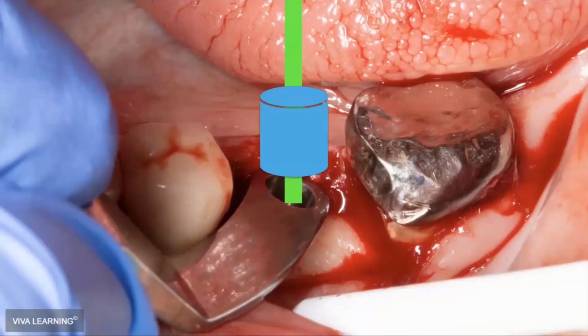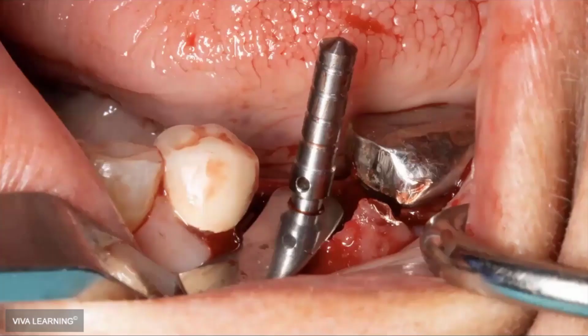The next question I had was, well, how do I know the angle that this key is in the bone? This is not a very sophisticated approach at this point. So what I did was I put one of my angulation pins into it and straightened it up to what looked right. And then I took the angulation pin out and used my laser to continue the osteotomy. Eventually, I was able to get to about 10 millimeters deep.